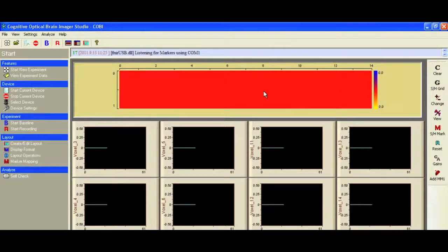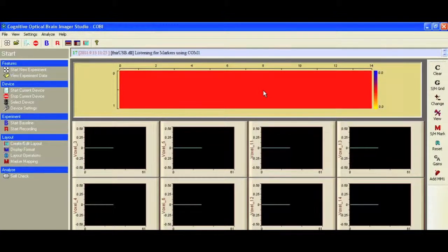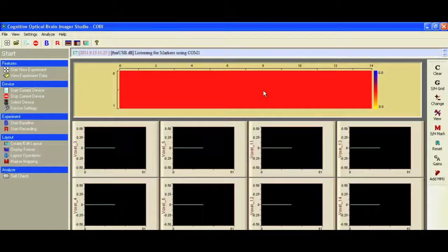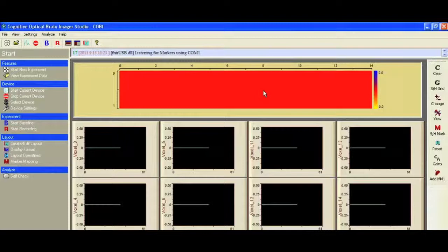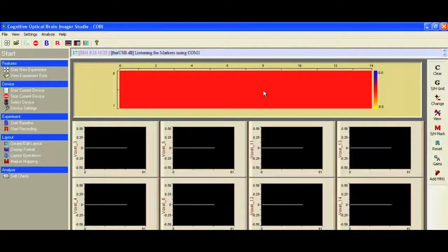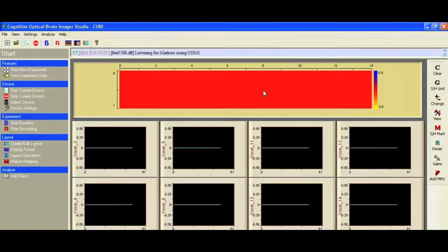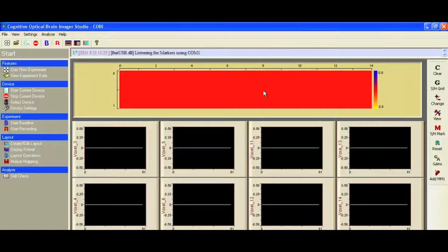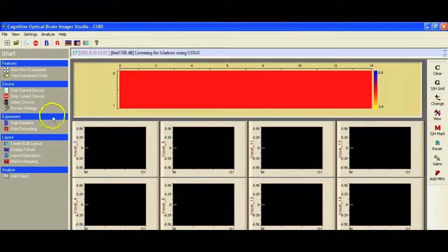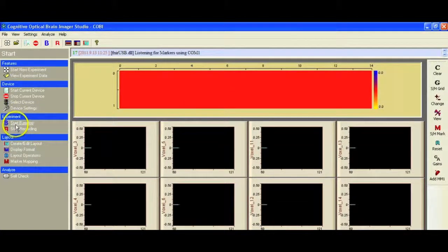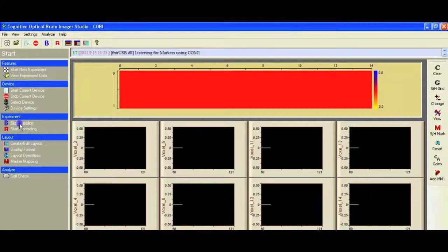But before we actually start collecting data we have to run a baseline. It's important during this part of the experiment that the subject is relaxed and they're not thinking about anything. One of the best techniques is just to look at the wall and really try and zone out as much as anything. So I'm going to hit start baseline.